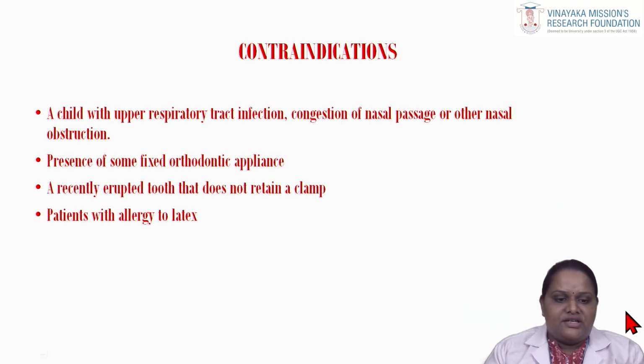So, what are the contraindications? A child with upper respiratory tract infection, congestion of nasal passage or other nasal obstruction, presence of some fixed orthodontic appliances which make it difficult for the operator to place it and take it out, a recently erupted tooth that does not retain a clamp, and patients who have latex allergy.